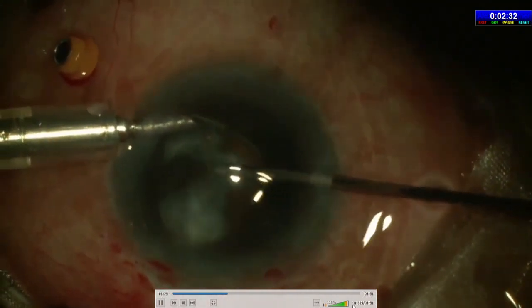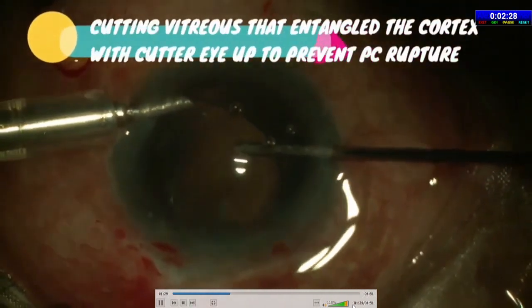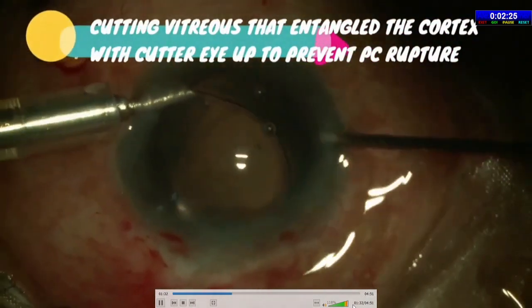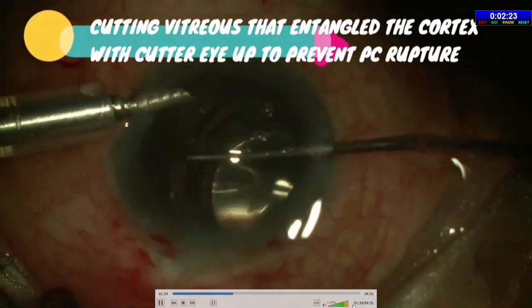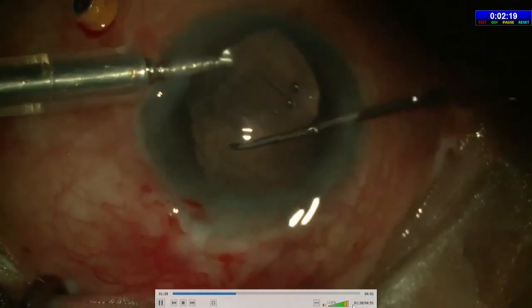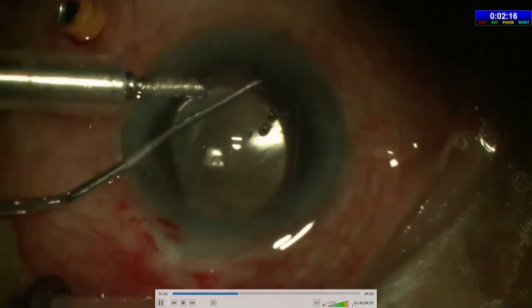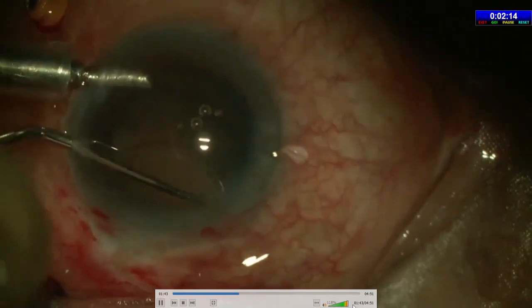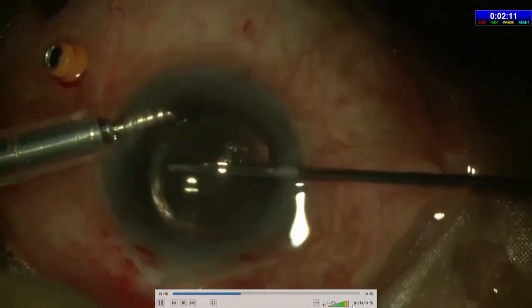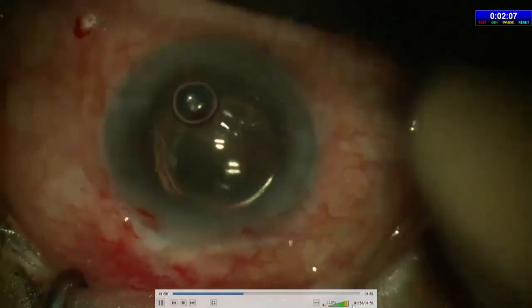I then removed the cortex from behind the partially prolapsed IOL slowly and gently, taking care not to rupture the PC, while aspirating the vitreous prolapsing from the zonules with intermittent cutting from under the IOL, keeping the cutter side up always. I then guided the IOL back in the bag, one haptic after the other. The haptics were rotated in the direction of maximum subluxation. After cleaning up the remaining cortex and vitreous and removing the pars plana port, I corrected the pupillary peaking by Sinskey hook sweeps.